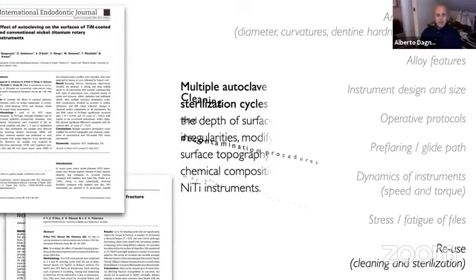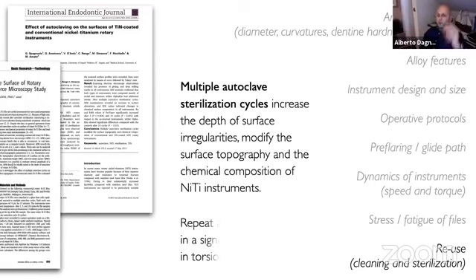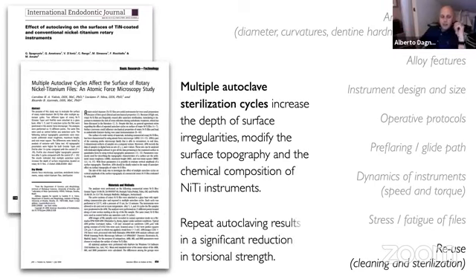At the same time, thermal stresses inside the autoclave due to the sterilization cycle can damage the file, increase surface irregularities, and modify the topography and the chemical composition of nickel titanium files.